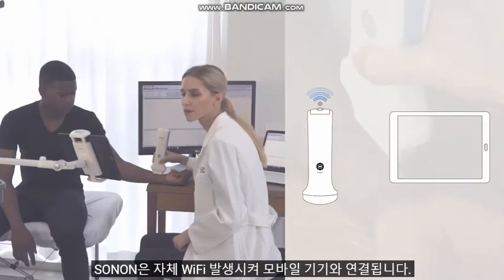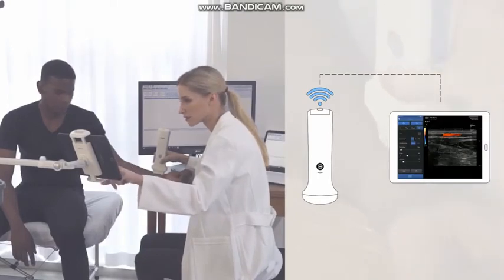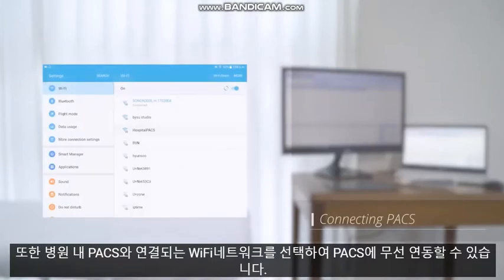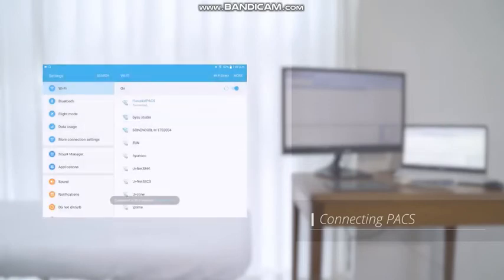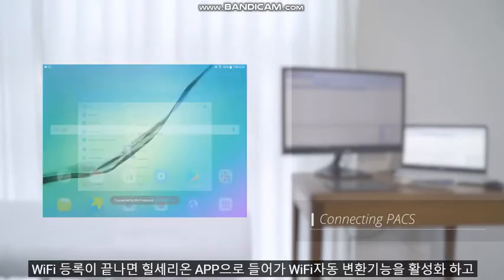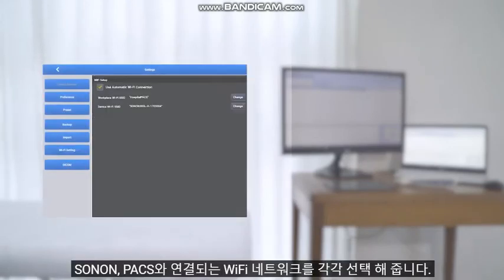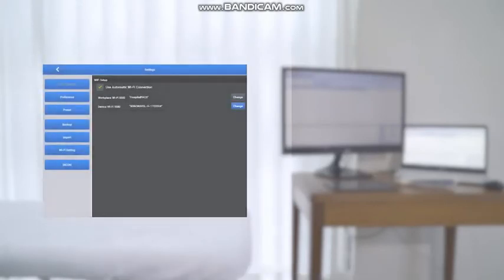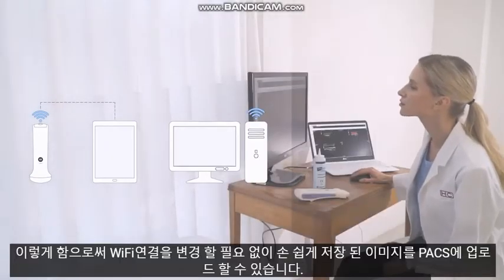Sonon generates its own Wi-Fi and connects directly to the mobile device. You can also select a Wi-Fi network to connect with PACS in the hospital for PACS connection. Once the Wi-Fi registration is complete, you can go into the app to activate the Wi-Fi auto-connection. You can select the Wi-Fi network that will connect to both Sonon Wi-Fi and PACS, allowing you to easily upload stored images to PACS without having to change your Wi-Fi connection.